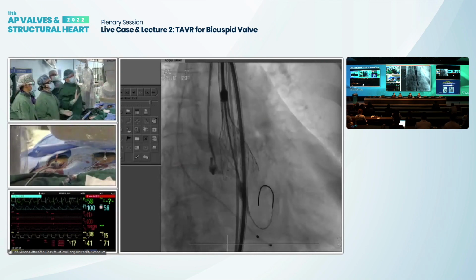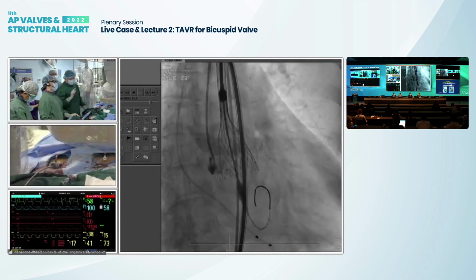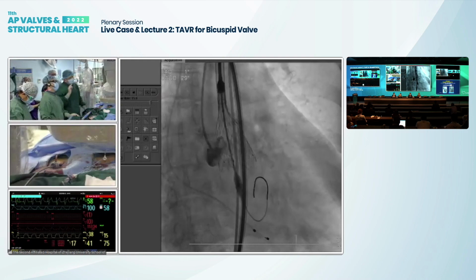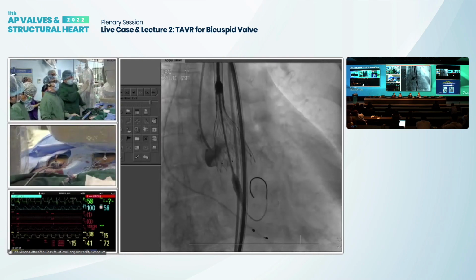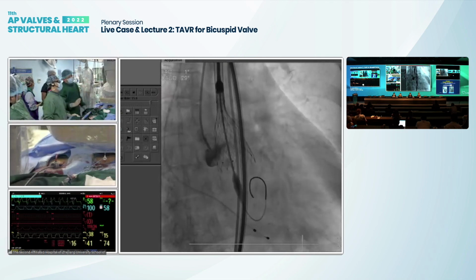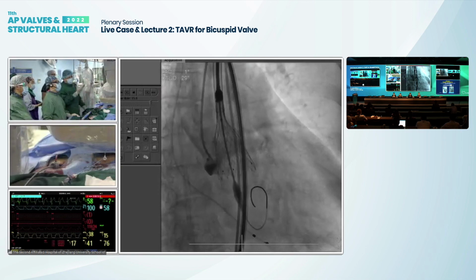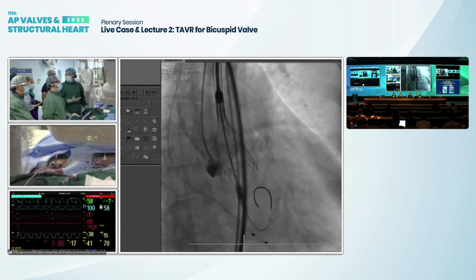We have released three times now. The first time you think it's too high. The second time you think it's too low. But now the height is between the first one and the third one. So if we want it a little higher, it may not be controllable. Maybe go back to the first time. Yeah, maybe. You have to accept.